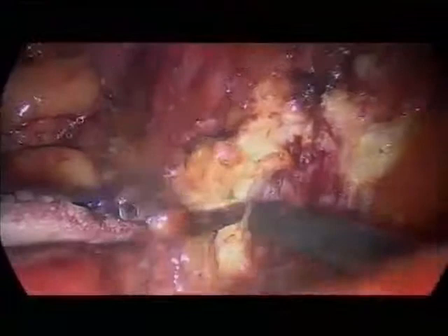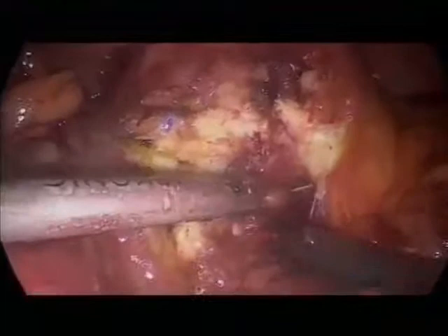And we are going to begin a radical prostatectomy by robotic approach.